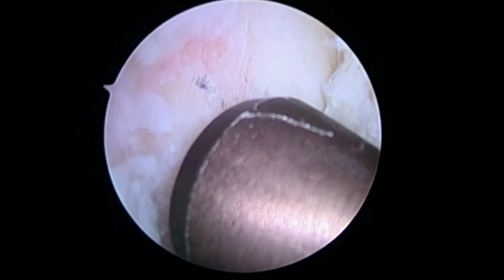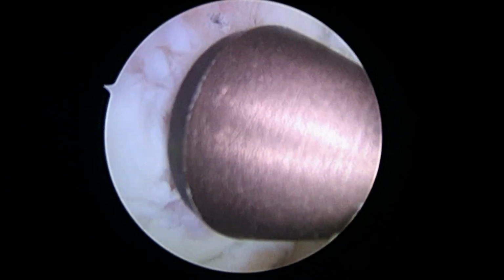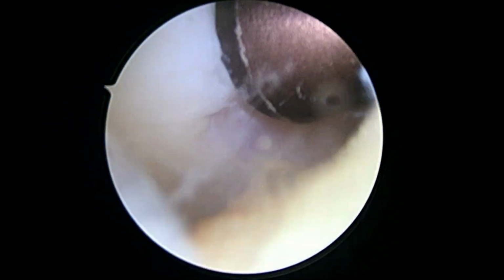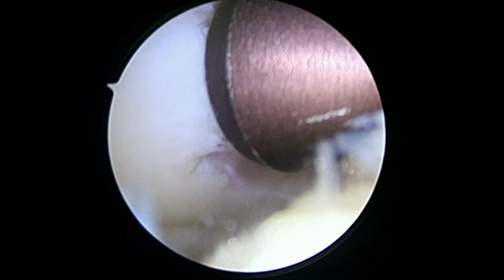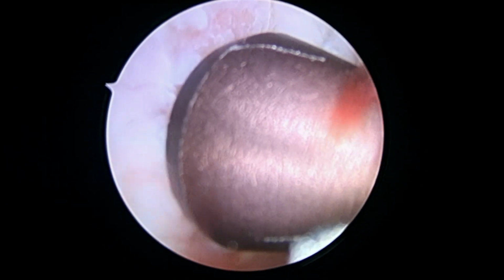Okay, so what we're looking at here is a 10 millimeter spacer, and you can see it actually fits pretty nicely right here. There's a little bit of a gap at the top, very little bit at the bottom, but it covers at least 90% of that defect, so I'm happy with that, and it looks like we can get things pretty flush like that. So that's what we're going to go with. Just wanted to show you how we check our size and our orientation here. I think that looks pretty good right there.